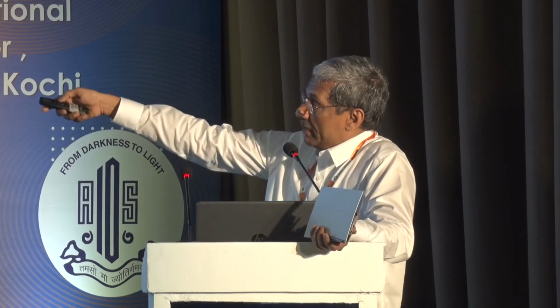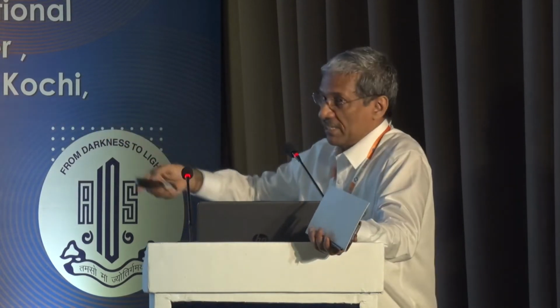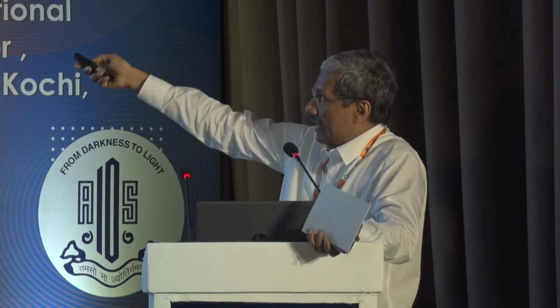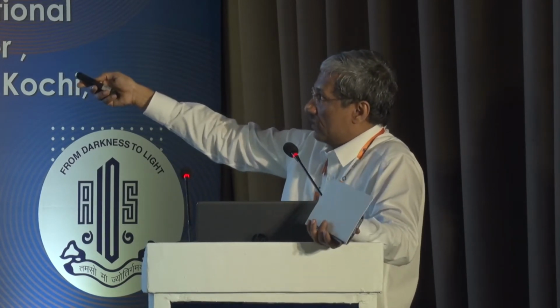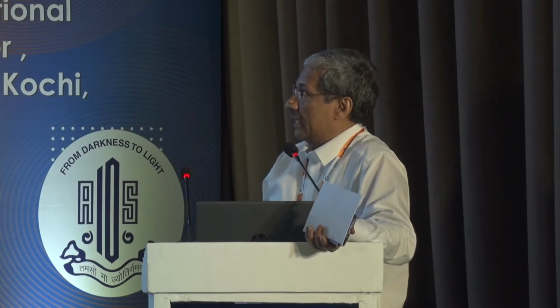Now, if you get a map like this, which is all even, showing oblique corneal astigmatism, you will say, go ahead, it's perfect. And if you do the full-fledged Galilei scan, or if you do a Cirrus or any of the standard Tomo or Topo, you will also get a normal scan.